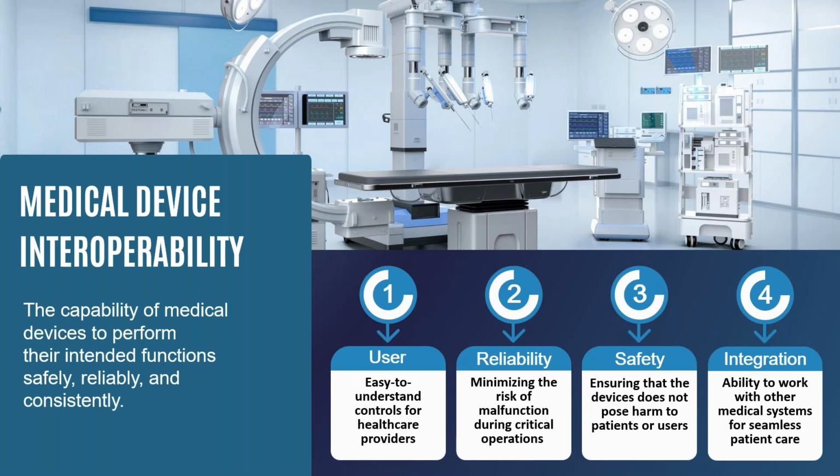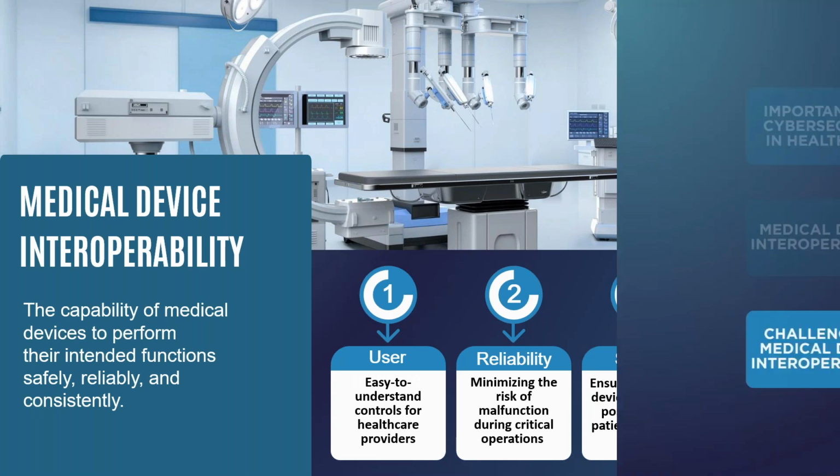And then the device also has to be reliable to use because any factors that aren't reliable need to be mitigated during those risk assessments. And then it has to be safe to use, whether or not that device has any past or existing incidents, that all needs to be factored in. And then obviously integration into the existing system, so the ability to work with all the other devices.